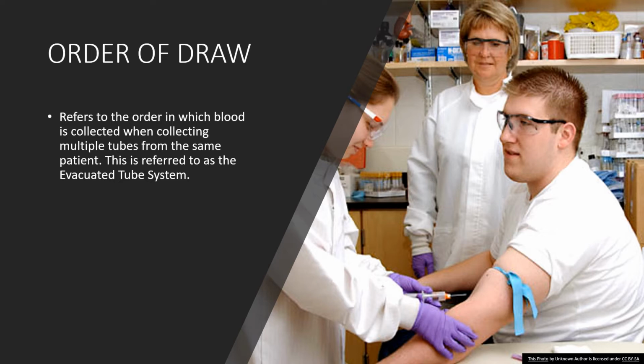Now what that means is that tube has had all the air drawn out of it. So the minute that sheathed needle on the inside of the holder breaks that seal, air starts to flow in, and that's what pulls the blood into the tube and starts automatically filling the tube up.